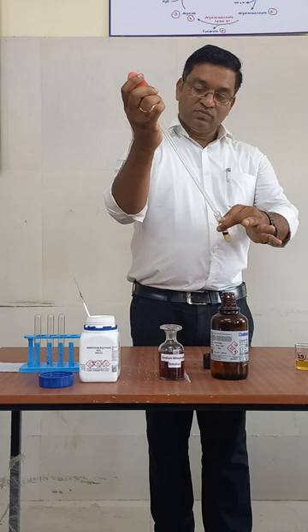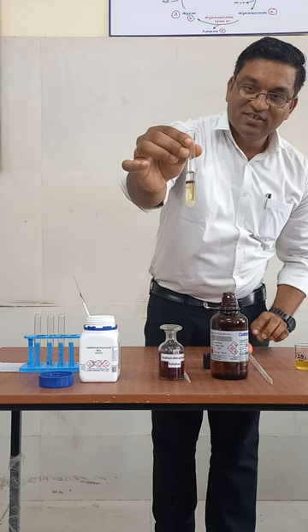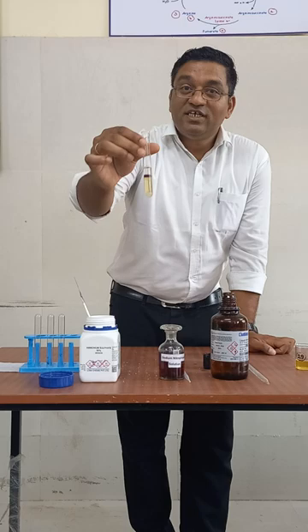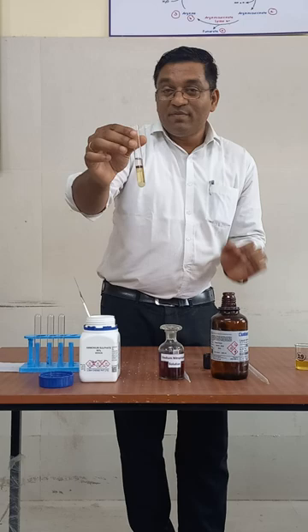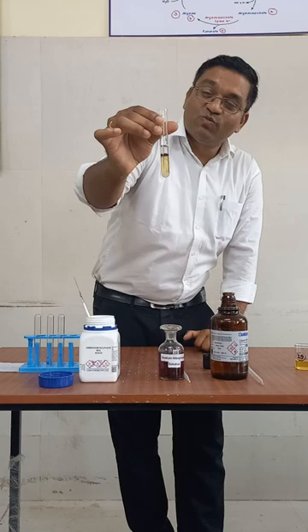See this — a deep purple ring at the junction of the two solutions. This is a positive Rothera's test, indicating the presence of acetone and acetoacetate in the urine. This means the patient may have diabetic ketoacidosis or may be in a state of starvation — both conditions where ketone bodies are expected in urine. A deep purple ring at the junction of the two solutions is a positive test.